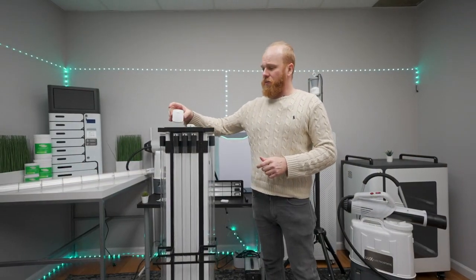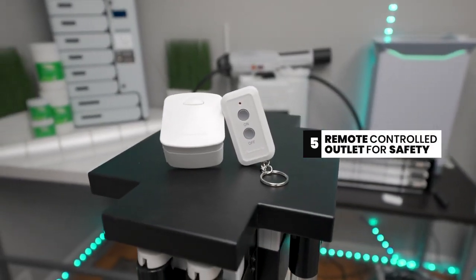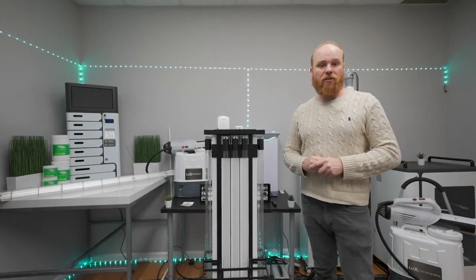On top of that, for safety reasons, we've included a remote-controlled outlet, which allows you to power on and off the device from a safe distance without being exposed to UVC.